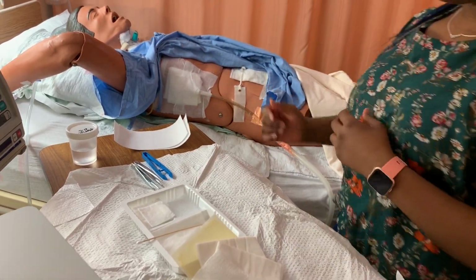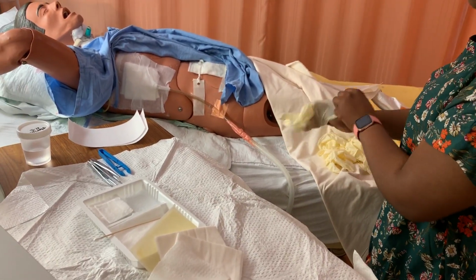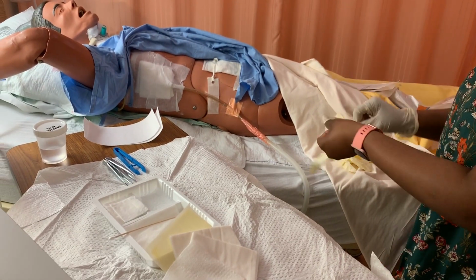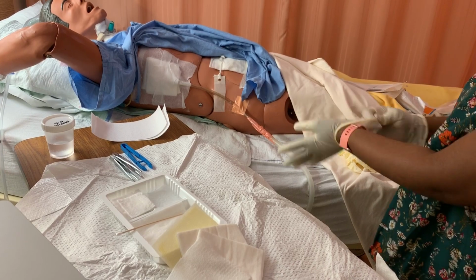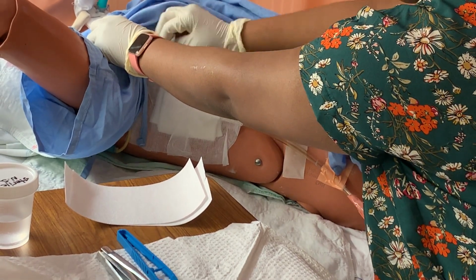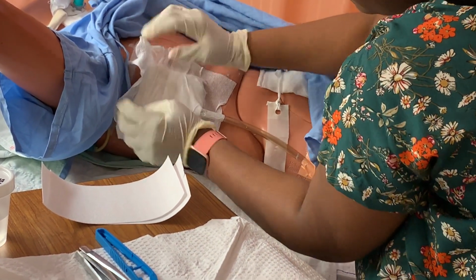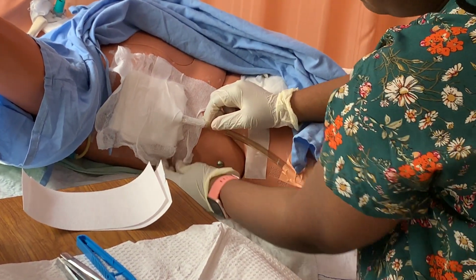So that's done, so now I'm gonna put on these gloves. Now I'm gonna take out the dressing. I'm not gonna put it on the patient's skin, and I'm gonna make sure I'm holding the tubing as well so it doesn't pull out.